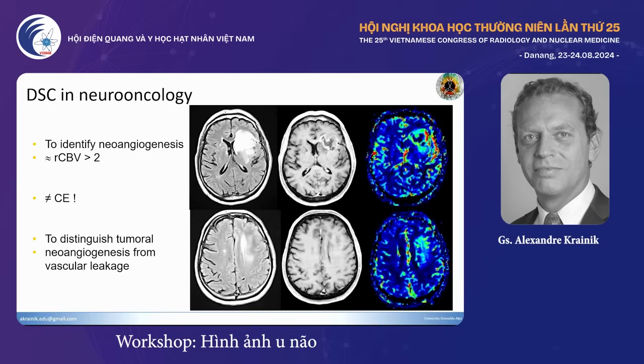The second thing is that you may have, for instance, hypervascularization, an increase in tumoral vessels, without contrast enhancement. It's exactly this example. You see here, you have a high CBV and an increase in density of brain vessels, of malignant vessels, and you see there's no contrast enhancement, meaning that here you have an increase of blood volume and malignant vessels, but for the moment, there's still no impairment of the blood-brain barrier, okay?